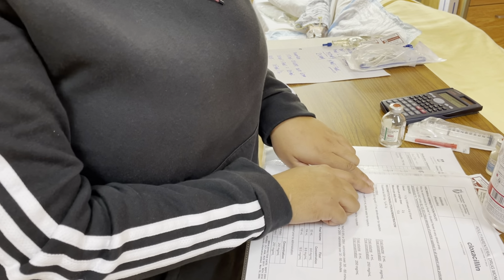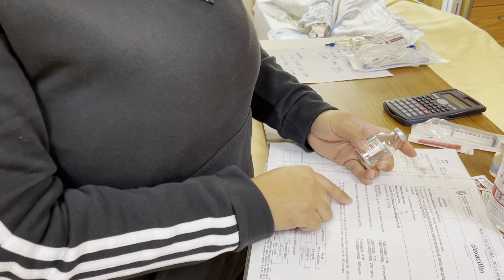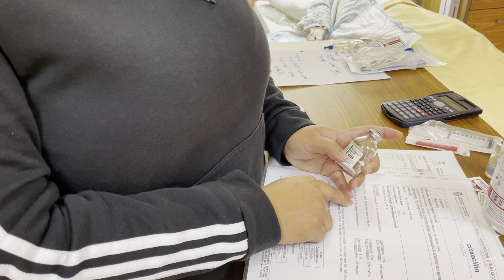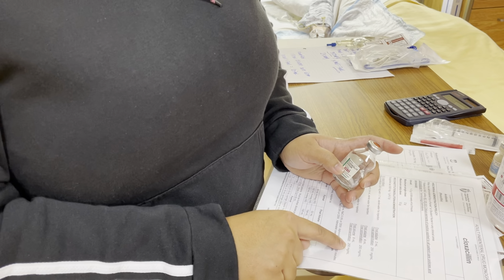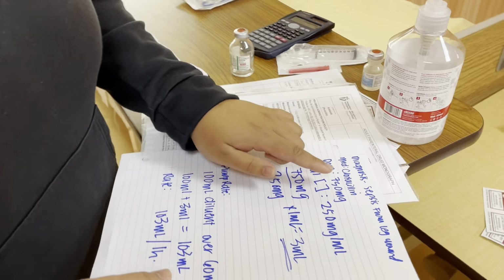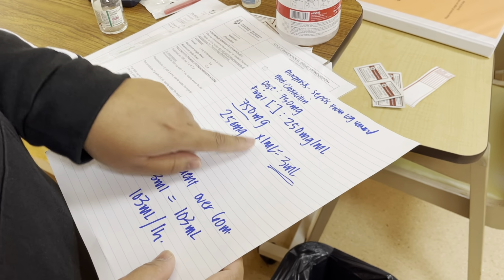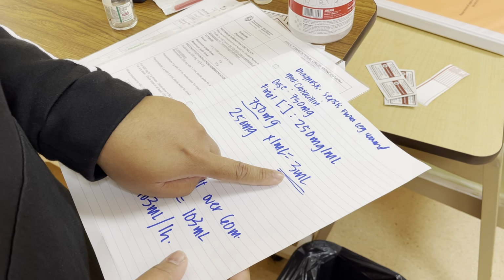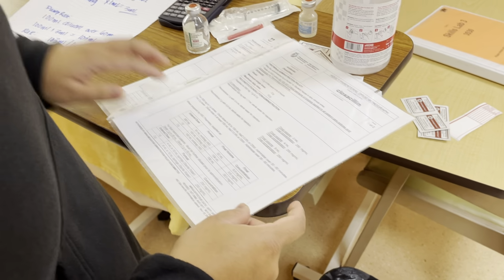And then it says we can administer via IV intermittent. For a 2 gram vial, which is what we have, we're going to reconstitute with 6.8 ml of sterile water for a final volume of 8 ml and a final concentration of 250 milligram per ml. I've already calculated the volume that we'll need to obtain the 750 milligram. For 750 milligram at a final concentration of 250 milligram per ml, we will need 3 milliliters of the reconstituted medication.